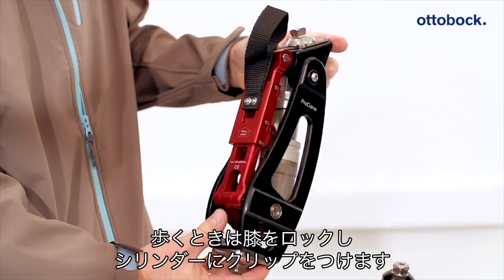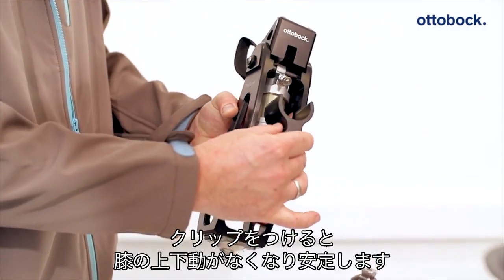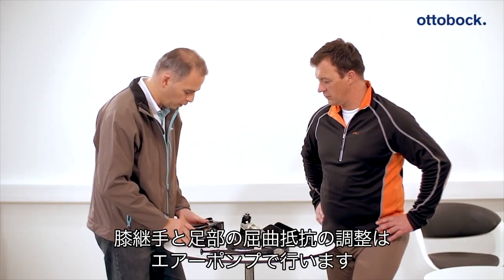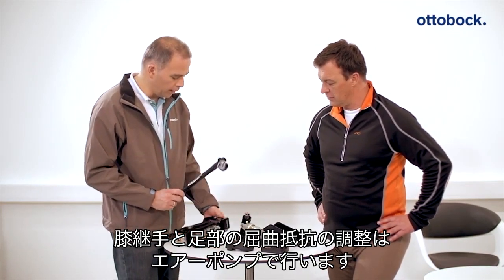The user can attach a blocking clip to the damping element to prevent uncomfortable deflection of the knee joint while walking. The flexion resistance on the foot component and in the knee joint is adjusted with the help of the high pressure air pump.